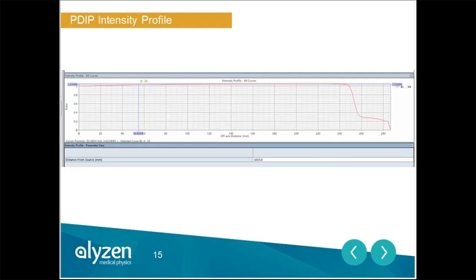That'll make a little more sense later, but we want to tell the algorithm the same thing that we're telling the panel. So whatever diagonal you use here, it's going to take this diagonal and sweep it radially, so you get a radially symmetric prediction. And you want to be able to tell the panel the same thing, and that's very important.